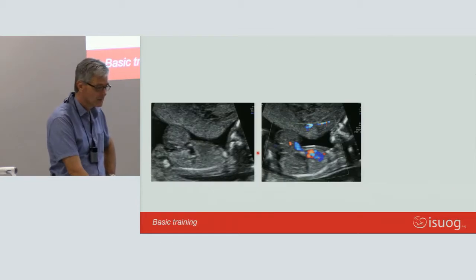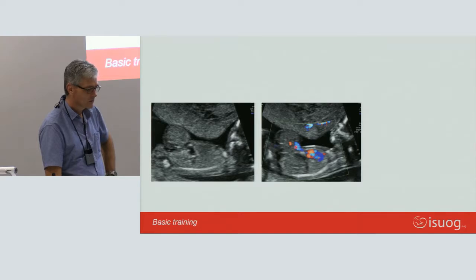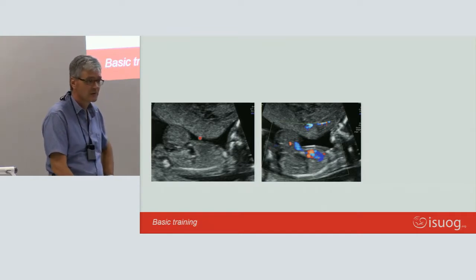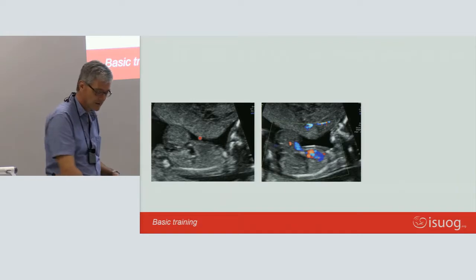In the vicinity of the bladder again, here we see color, a bit naughty, but we see color there. So we actually see the umbilical cord running inside this lump on top of the baby's stomach, which is of course an omphalocele. And why omphalocele, not gastroschisis? Because it's got a membrane around it.